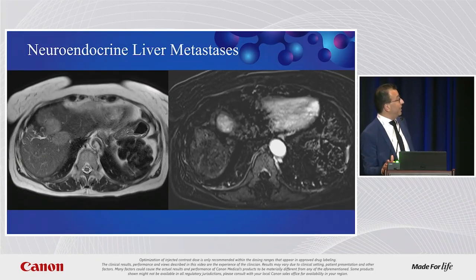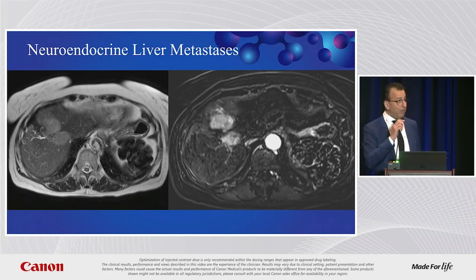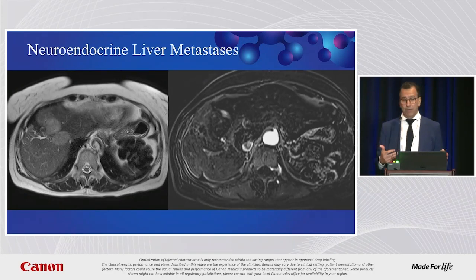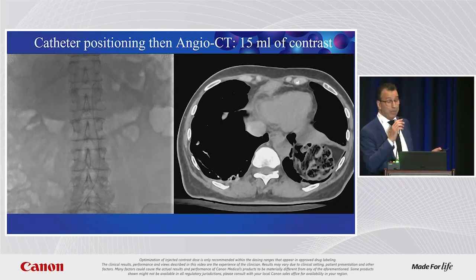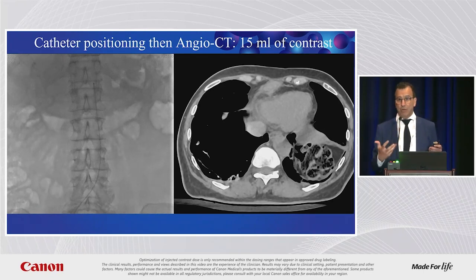Here we are, another case. That's a recent case I did last week. That's a patient I like a lot. For 10 years I have been following her for a neuroendocrine Mets of the colon. Many ablations done, and she comes back with this new lesion, now having a huge Mets nearly at the biliary tree. It means I cannot do thermal ablation.